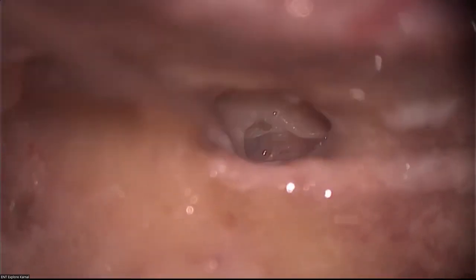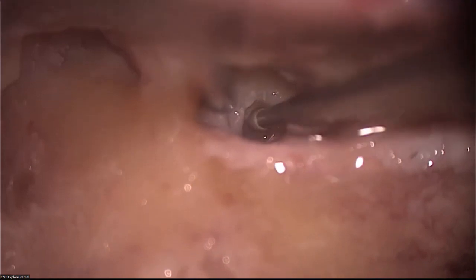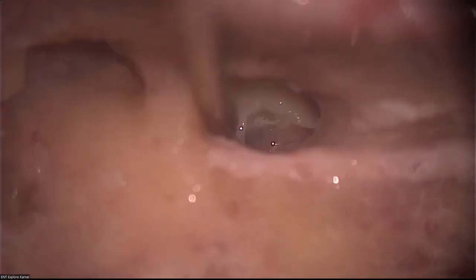This is a little bit of the niche. See now, more and more of the round window is coming into view. This round window is the backdoor entry to the scala tympani. See now, the round window is completely uncovered.